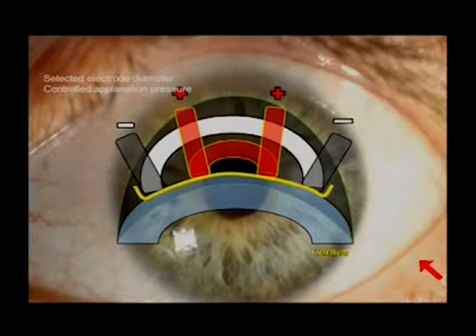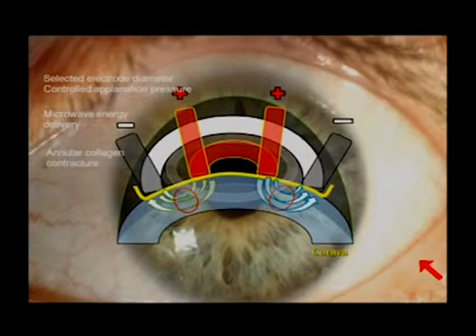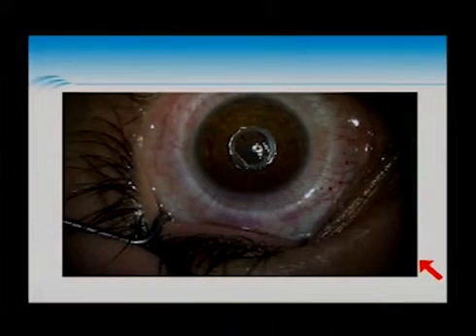Electrodes deliver the energy. You can determine the diameter and the depth of treatment. You can cool the surface to preserve epithelium if you like. All of these are adjustable. The energy is produced and the cornea is heated. Here's a picture immediately after the application of an annular ring on this patient with myopia.